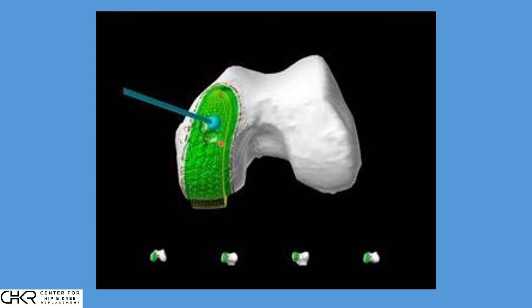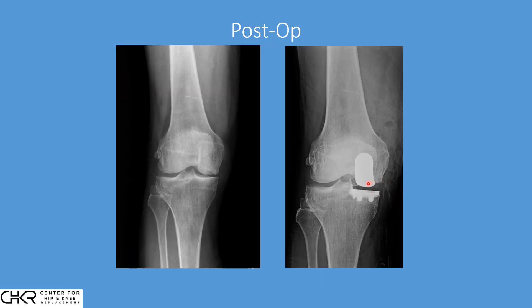At the time of surgery, once we've confirmed our registration, we fix the knee. The best way to think of the osteochondral defect is like a cavity — and just like a dentist fixing a cavity, we use a burr to clean out the necrotic tissue at the surface until we get to healthy bleeding bone. We bring in our robotic tool, which has already been programmed based on our preoperative planning to the appropriate depth, length, and width. We use this burr to clean up the cavity and prepare the bony surface, then cement on the implant, which recreates the smooth condylar surface so the knee can transmit load through the inner column as it did prior to the osteochondral defect.